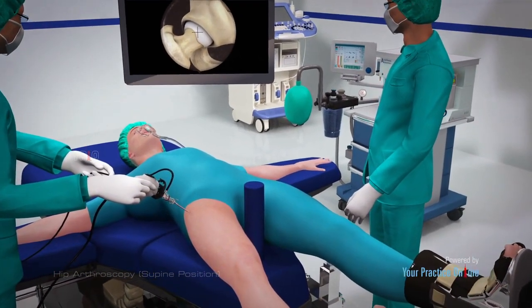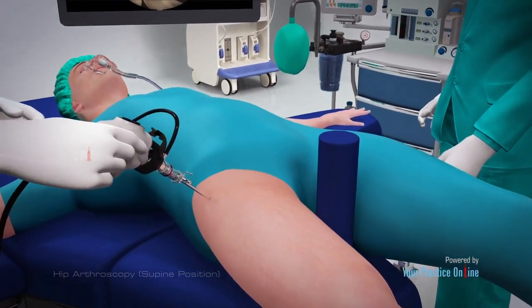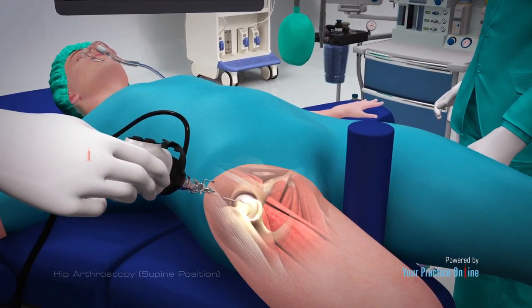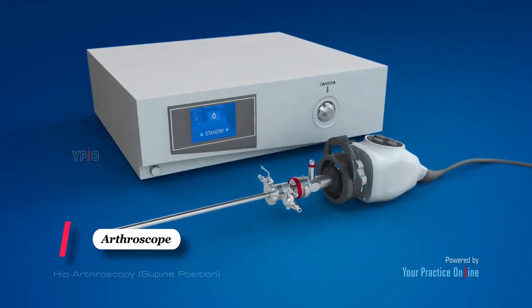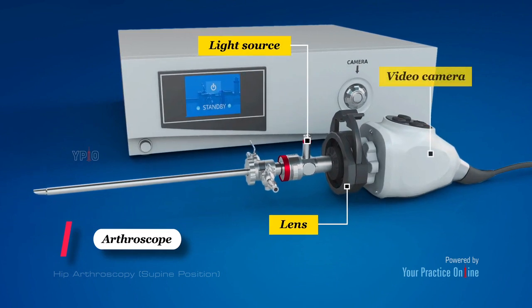Arthroscopy, also referred to as keyhole or minimally invasive surgery, is a procedure in which an arthroscope is inserted into a joint to check for any damage and to repair the problem at the same time. An arthroscope is a small fiber-optic instrument consisting of a lens, light source, and video camera.